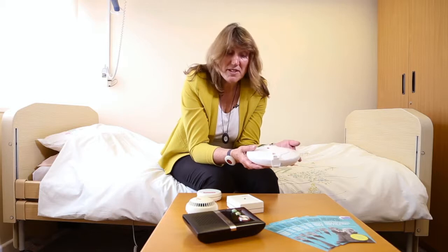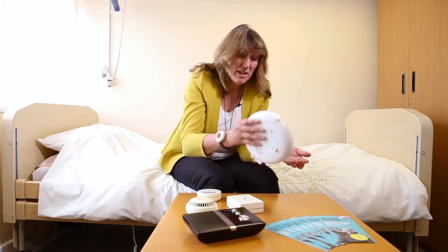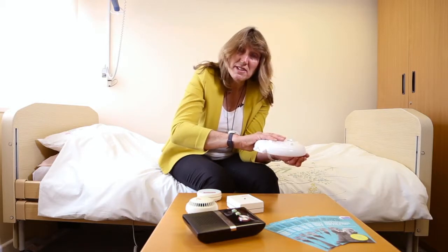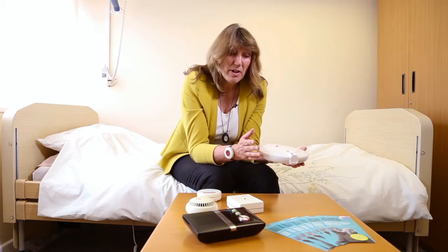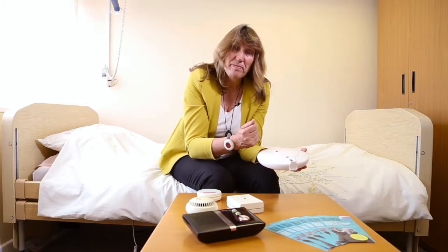What happens then? The person then has to pick up the medication dispenser, turn it over to dispense the tablets, and it will stop beeping. All of it can be set with different time scales. It can beep, if you so wish, up to an hour, but it can be set to the person's needs. Obviously, if the person doesn't respond to the beeping and flashing of the dispenser, then the care line will get the alert to say that the person hasn't taken their medication. They can then ring the person to remind them to take the medication.